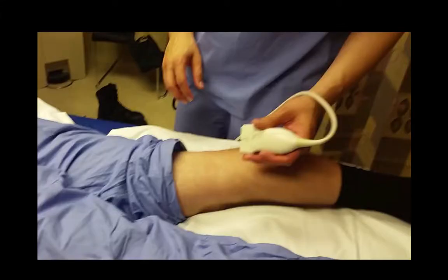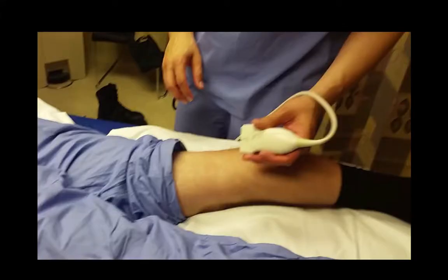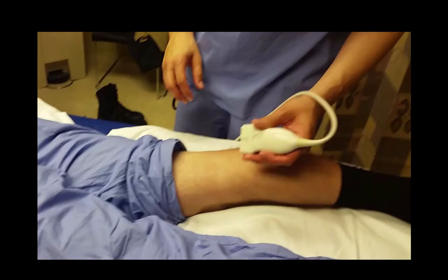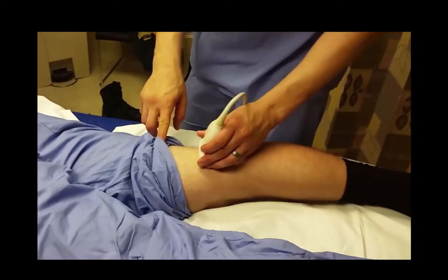So now let's move on to the popliteal area. As far as the technique, it's similar in the sense that you try to find that vein and see if it's compressible or not. If you can have the patient move prone, it's going to be a little bit easier for you to do your examination.